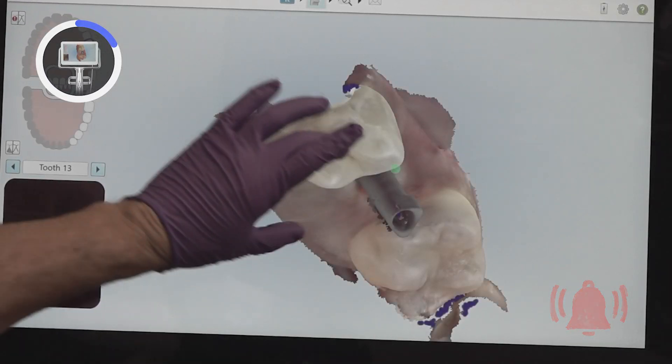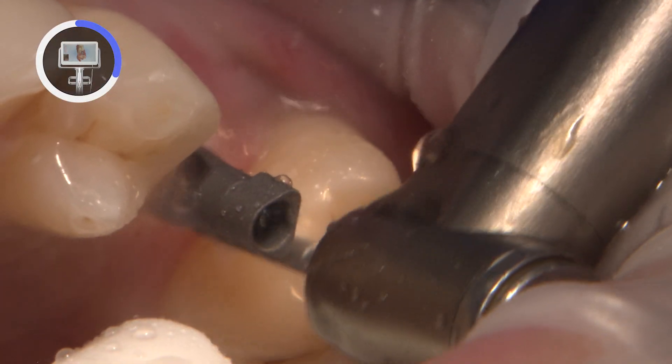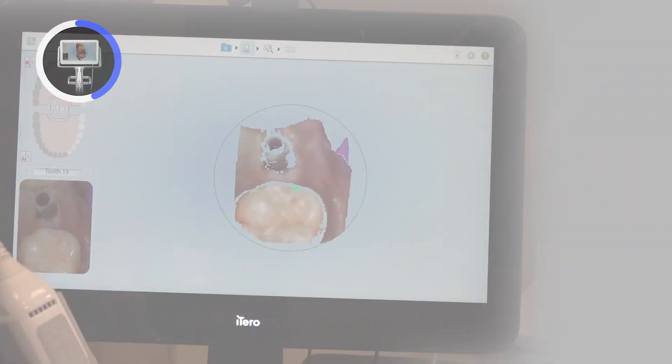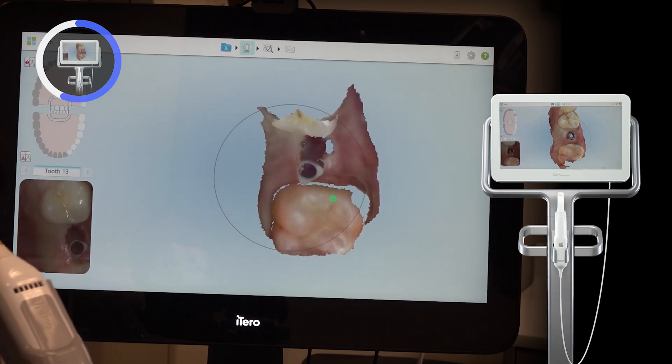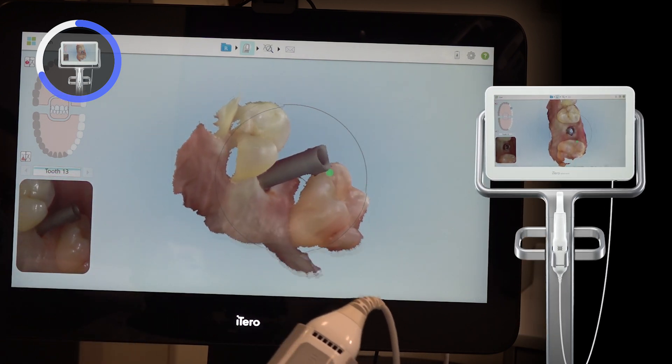In this case, the distal contact needed a little further adjustment. Once I am happy with the contours of the adjacent teeth, I re-seat the scan body and hand tighten it into place. Before the final scan is captured, I recommend the seating of the scan body is confirmed with a radiograph to ensure there is no hard or soft tissue impingement.